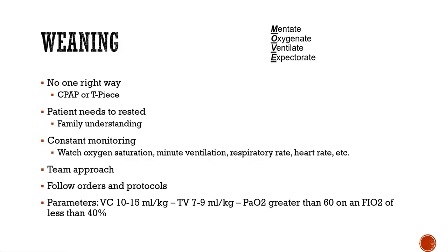Okay. So weaning, so we have a little mnemonic up here. So mentate, oxygenate, ventilate, and expectorate. There's really no one right way, either CPAP or a T-piece, if you're on a trach. Patients need to rest, and families need to understand that.